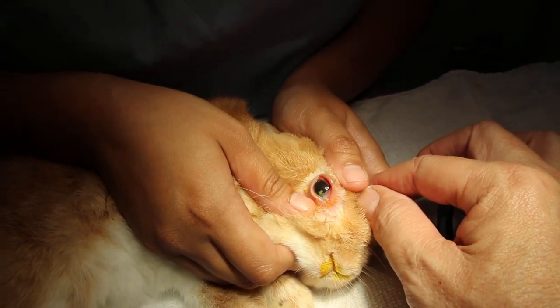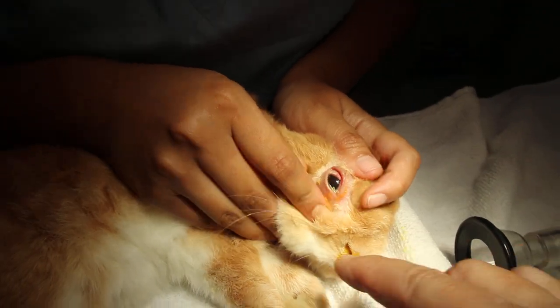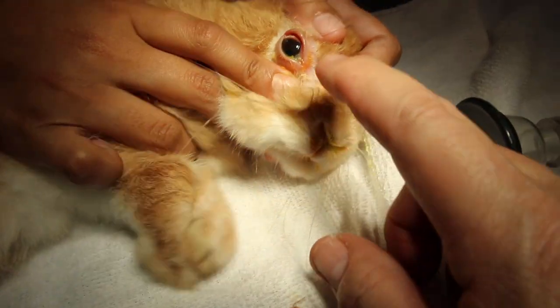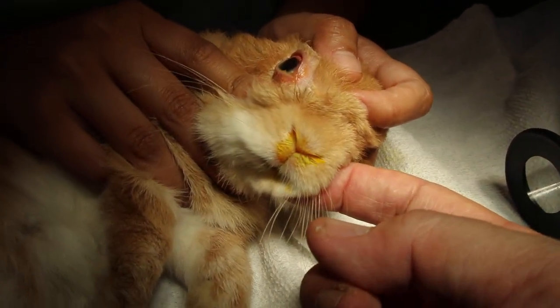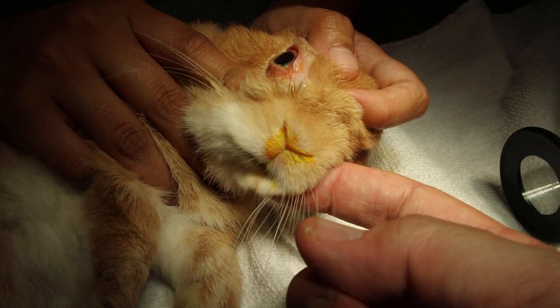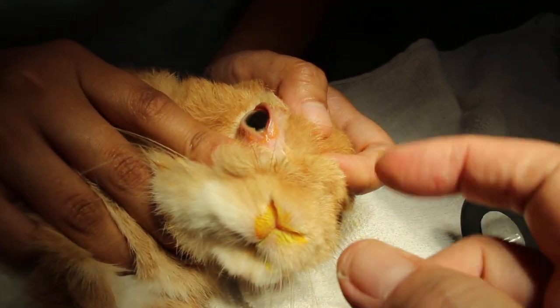Judy, come and do the irrigation. There's no green. So you can see the fluorescein stain come up from the nose, which shows that the tear duct is patent. That means there's no obstruction of the tear duct.